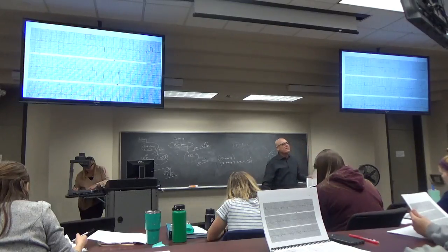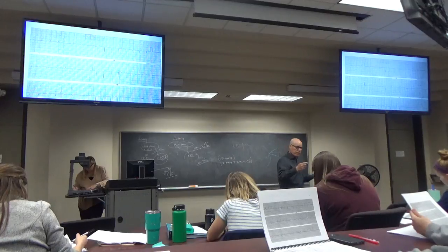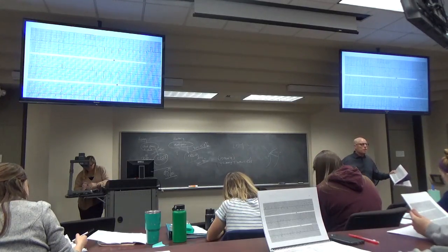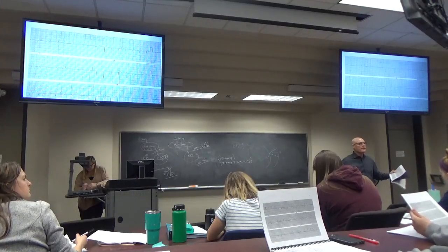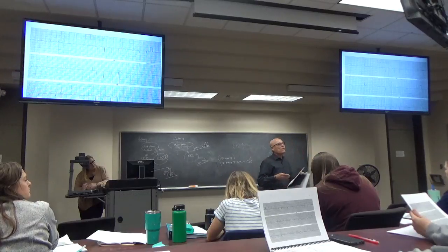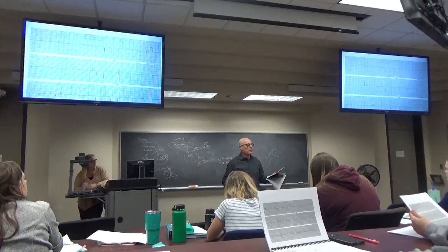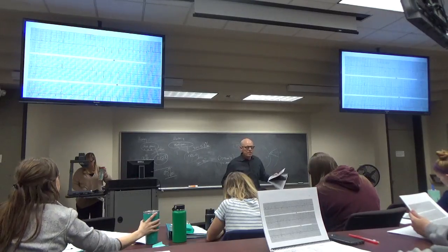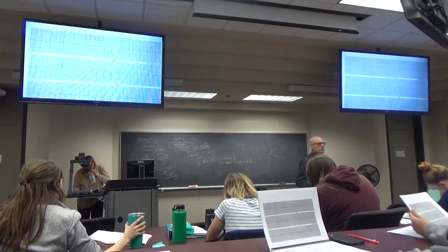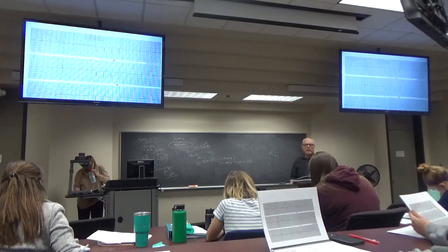Since there's an infarct in V1 through V4, and it's a Q-wave infarct, that means you've got a huge left ventricular infarct, right? And V5 is sitting right next door to it. So the electricity through V5 is probably going to look weird. It's not likely to look pristine. That's why 5 and 6 look weird. You're just starting to Q-wave there. It doesn't matter because it doesn't affect what we're reading.